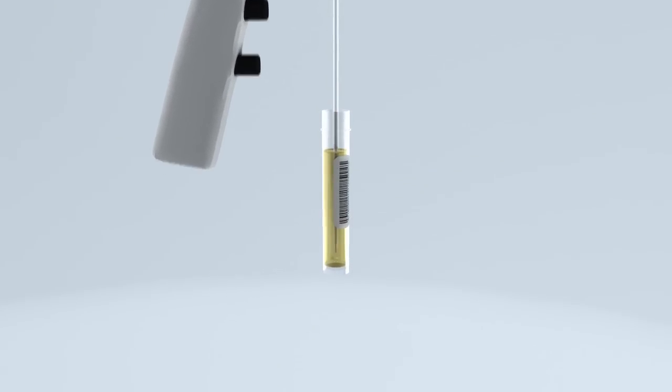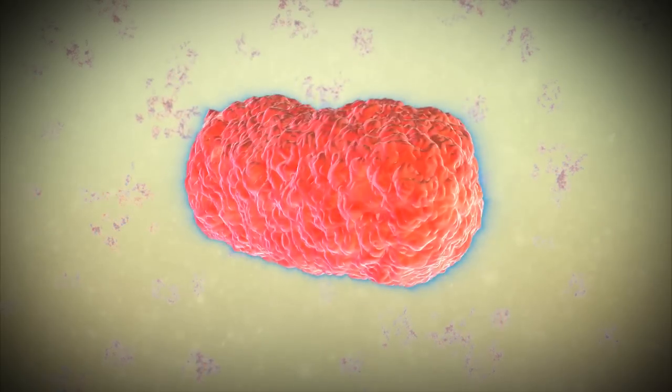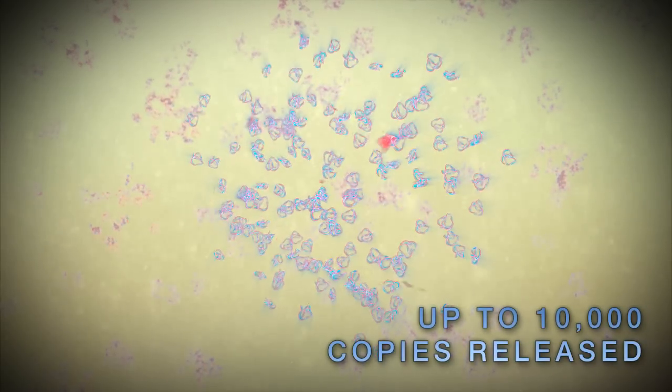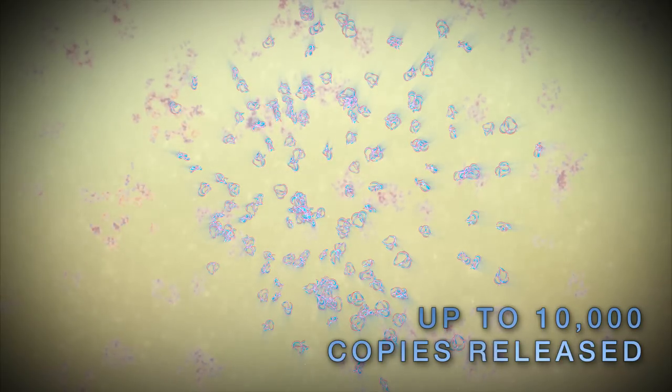Sample preparation requires a single transfer from the enrichment bag to the ROCA transfer tube. When the sample is added to the tube, the lysis of the bacterial cell walls results in a large number of ribosomal RNA targets being released, increasing the sensitivity of the assay over other conventional methods.